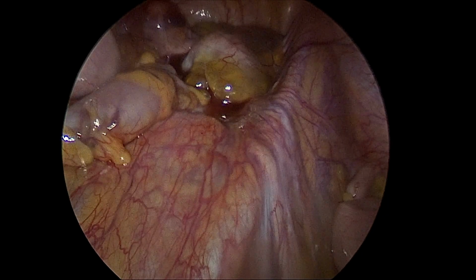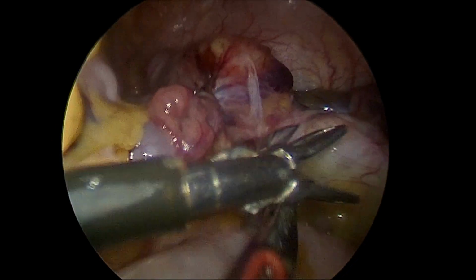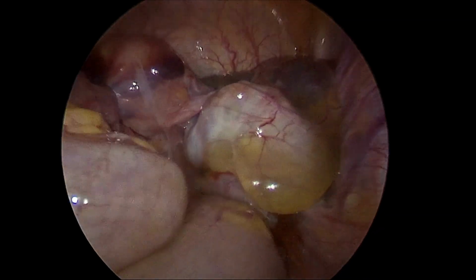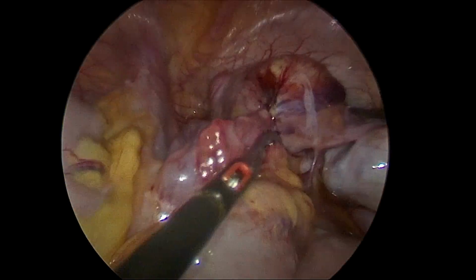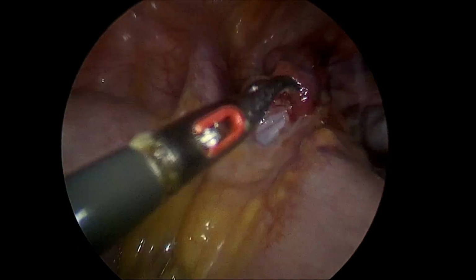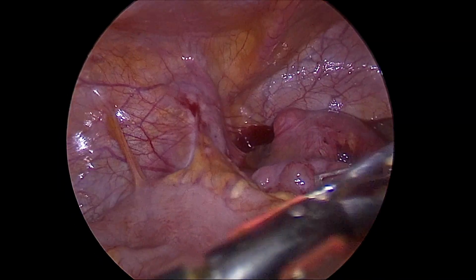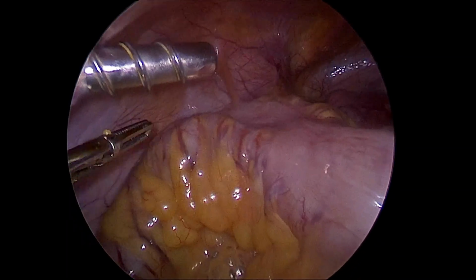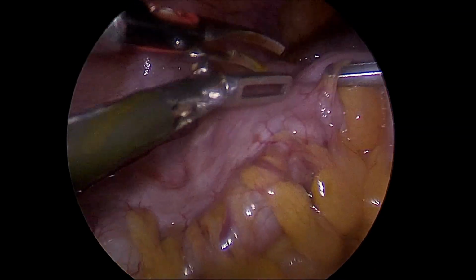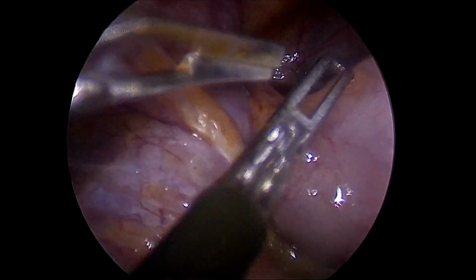Hello friends, this is a case of a 30-year-old girl who came to us seeking fertility treatment. On ultrasound, there were bilateral endometriomas and we saw a lot of para-ovarian cystic lesions which, according to us, were peritoneal inclusion cysts. So we did an MRI. MRI showed bowel to be adherent to the POD and bilateral endometriotic cysts. So this is the laparoscopy.